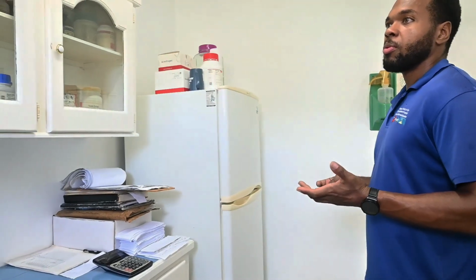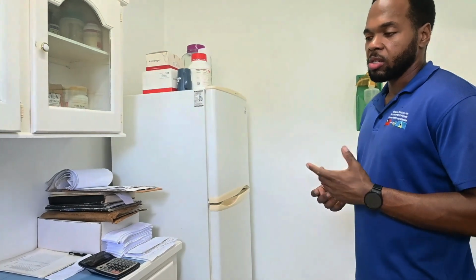We're at the plant tissue culture lab. Today we are going to be doing the process of creating the growth medium. The growth medium is basically all the nutrients and salt that are found naturally in the soil. In its chemical form, we're going to take it and create what is called a stock solution.